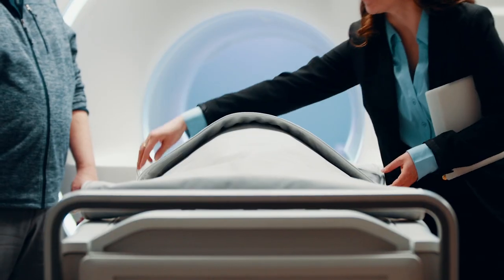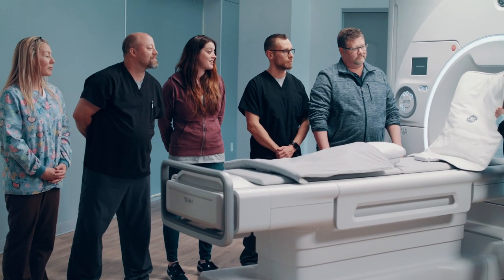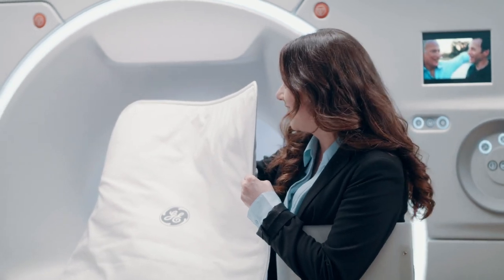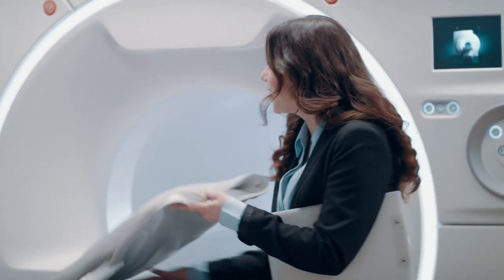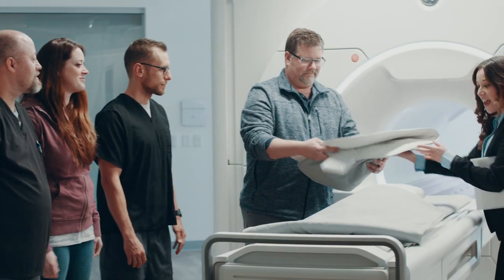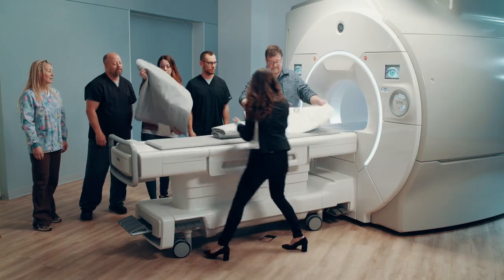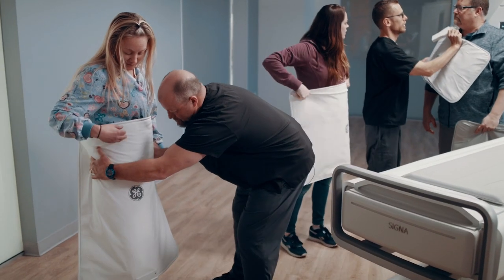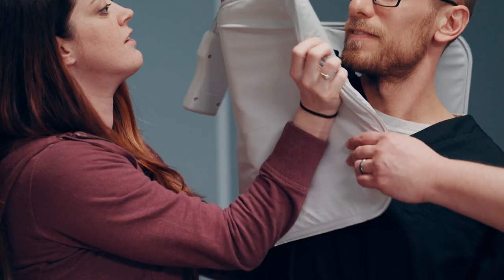What do you think GE has under here? Some type of new coil. This is GE Healthcare's new Air Technology coil. Very cool. It's like a blanket. Here, go ahead, hold it. And actually, we have more coils under here. It's light. Do you see that handle? It's nice, easy to handle. Very versatile. Very durable. Easy to clean.